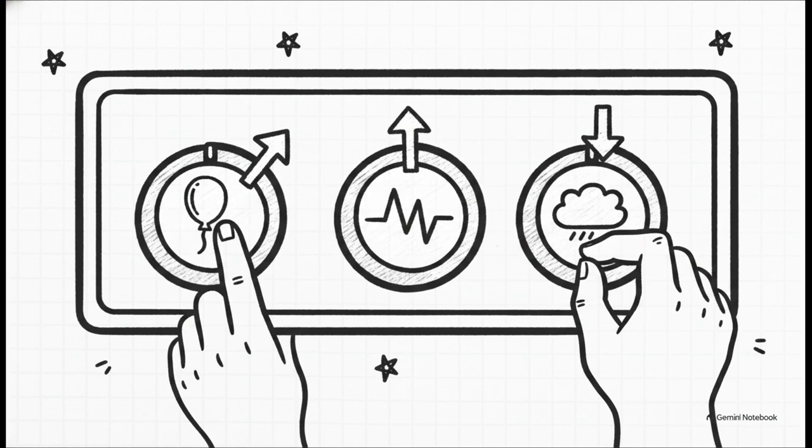Okay, the absolutely critical takeaway here? Look at that elevated bicarb. This is a compensated respiratory acidosis. They are a chronic CO2 retainer. You must never rapidly blow off their CO2 or you'll cause a severe alkalosis. But you do still need to adjust the vent.